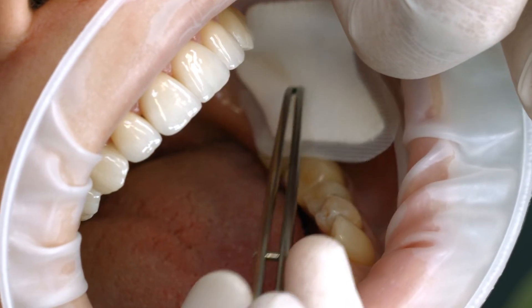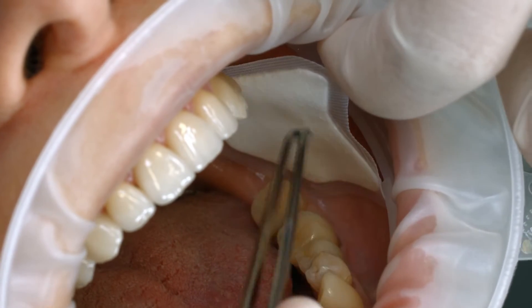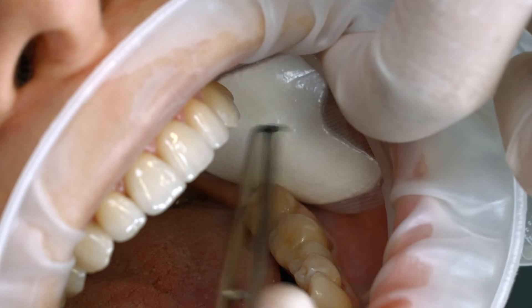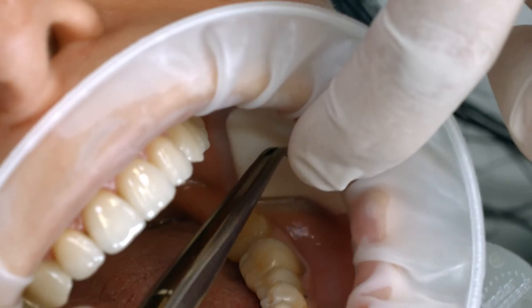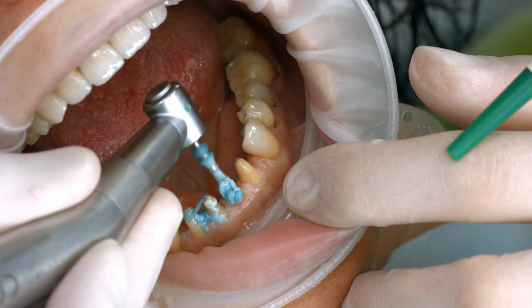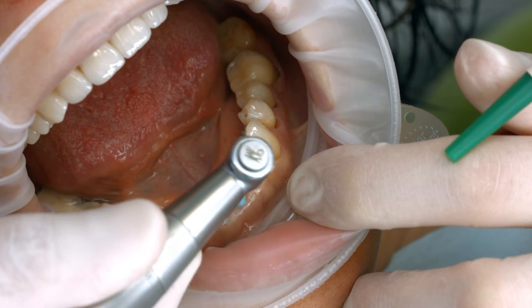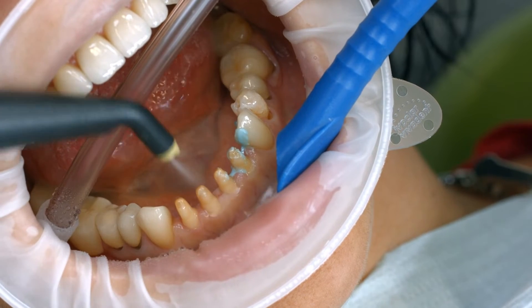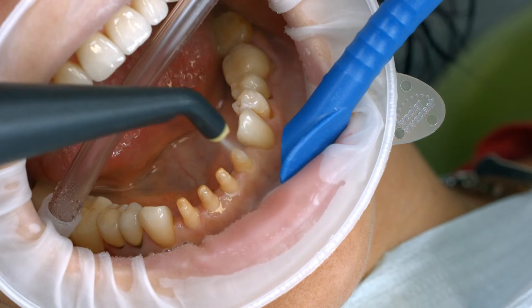A relative isolation of the treatment field is indispensable for the adhesion cementation with composites. Preferably use an anatomically shaped rubber dam, such as the Optradam. Alternatively, use absorbent pads and a saliva ejector. Clean the preparation again with a polishing brush and a fluoride-free cleaning paste such as fluoride-free Proxit. Rinse the preparation with water spray, dry it with air, and avoid over-drying.